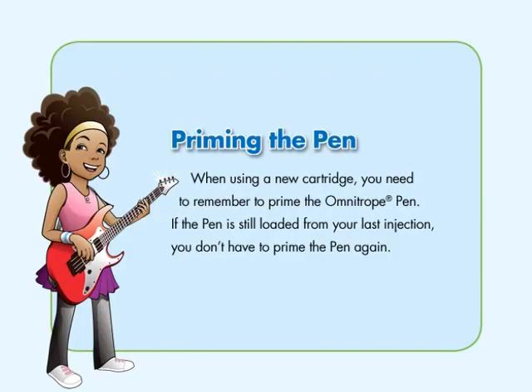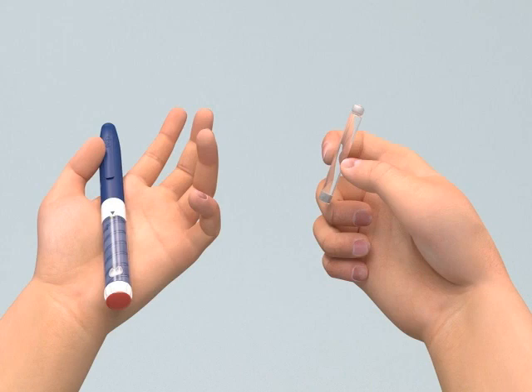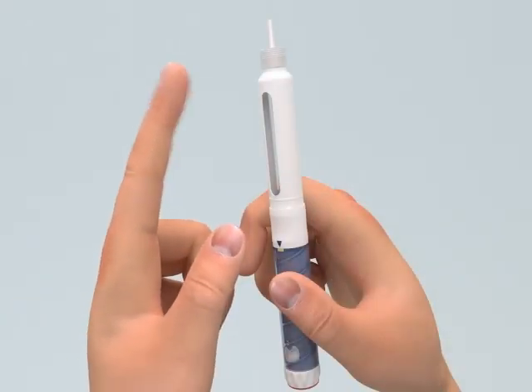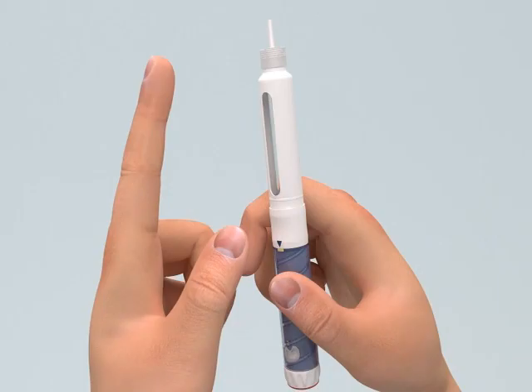If you're using a brand new cartridge, you need to prime your Omnitrope pen. Priming is only needed when the cartridge is new. Carefully inspect the solution before injecting. You should only use the cartridge if the solution is clear and colorless. Hold the pen with the needle pointing upwards. Gently tap the cartridge holder with your finger to help air bubbles rise to the top of the cartridge.